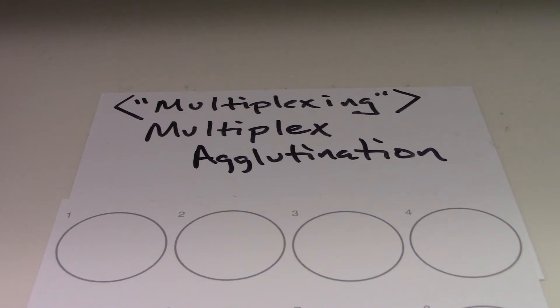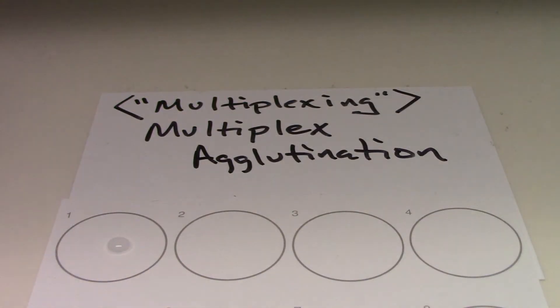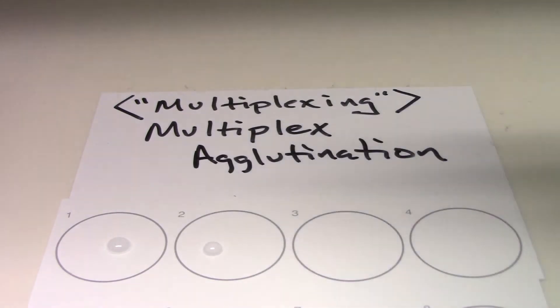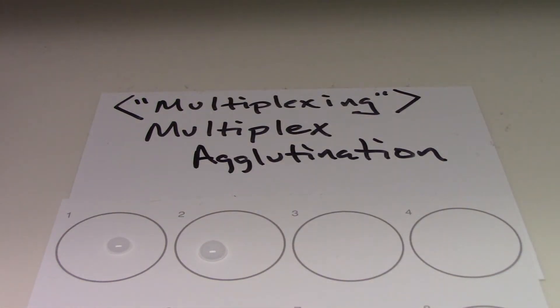The first thing I'm going to do is I'm going to add three different specimens. So I have specimen number one, specimen number two, specimen number three.